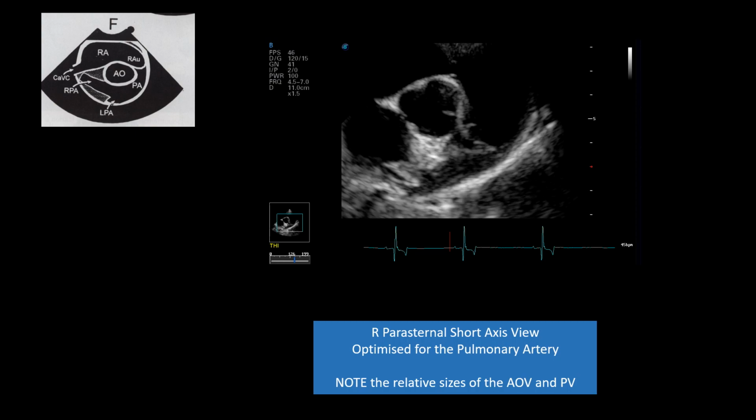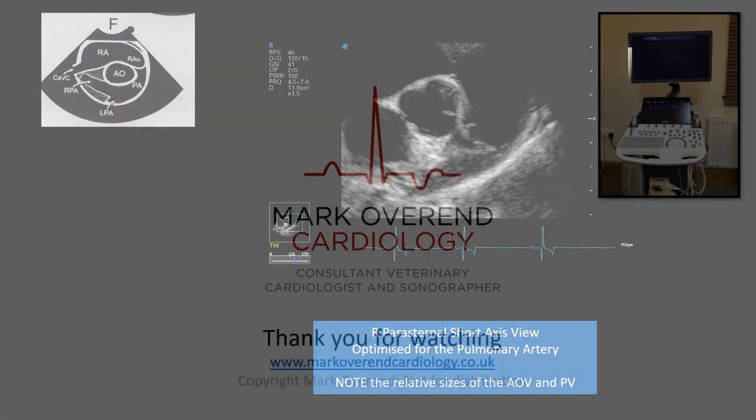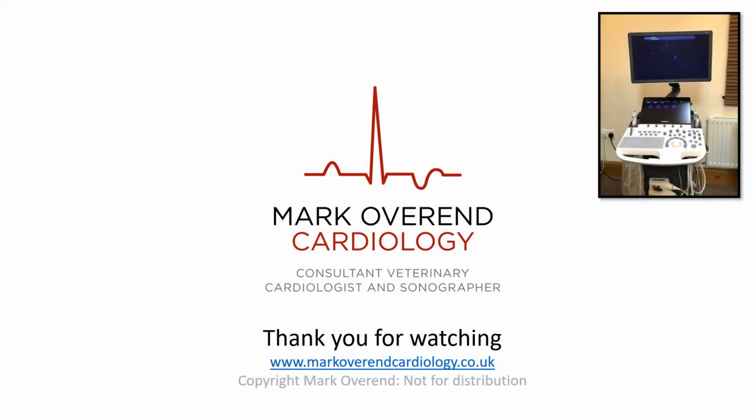So there we are. Hope that helps, just to get your head around the probe positioning for the right parasternal views. Okay, thank you.